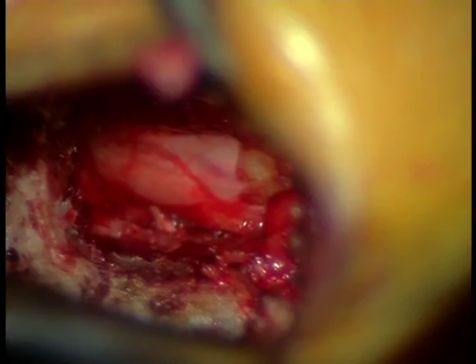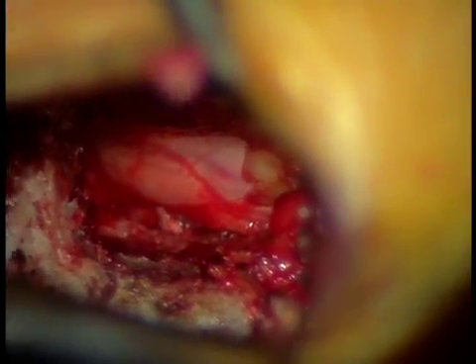Here now you can see the nerve root. The nerve root is being pressed up against us and we're going to start to mobilize the nerve. The nerve tends to get stuck from that disc herniation, and what we do is move the nerve and then find the hole where the herniation is coming out. Here you can see a small nerve hook getting into the defect where the herniation is. We start to mobilize it — this material is very adhesive — and once we mobilize it we can grab it and pull it out of the canal.